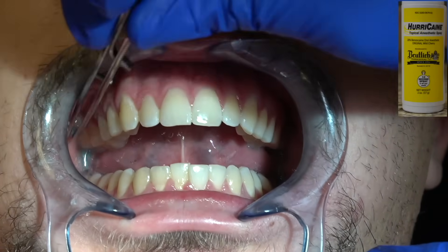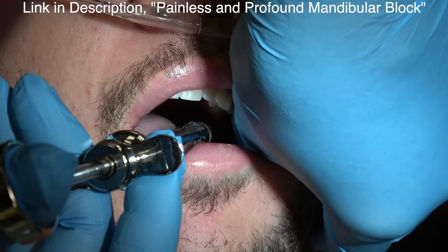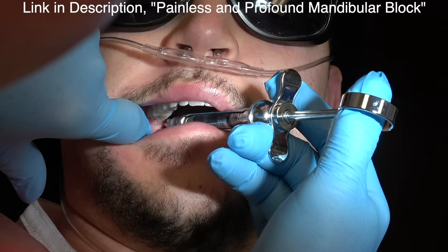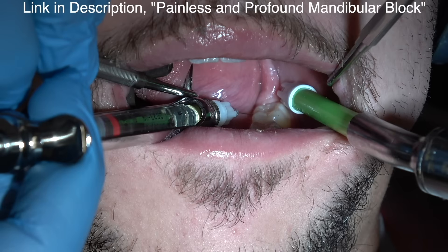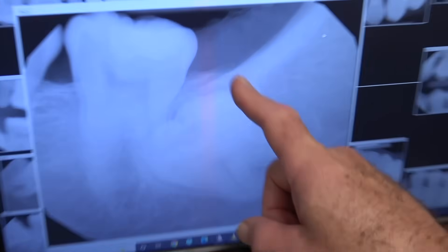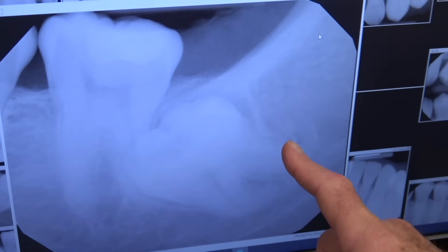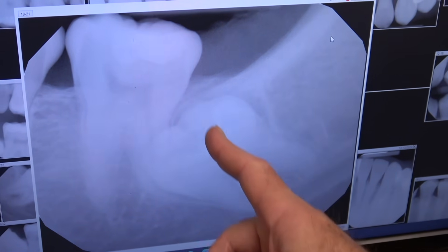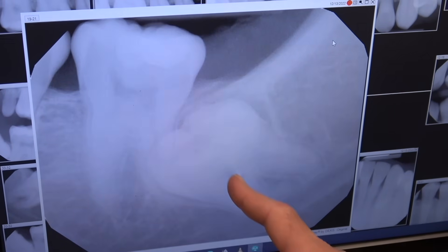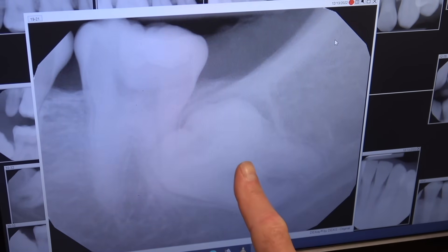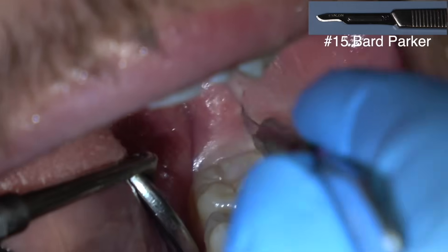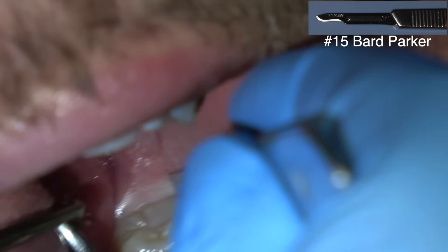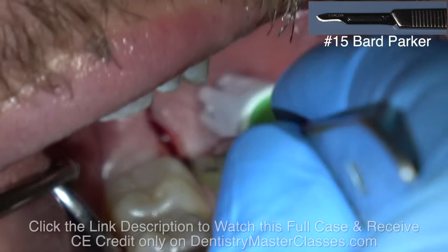So local anesthesia — you can see he couldn't open real wide either, because he'd been having some trouble with his wisdom teeth. There was some inflammation back there. I'm showing how I'm going to create the space, section to the furcation, elevate the distal piece, and then elevate the mesial piece. So it's easier drawn than actually done.